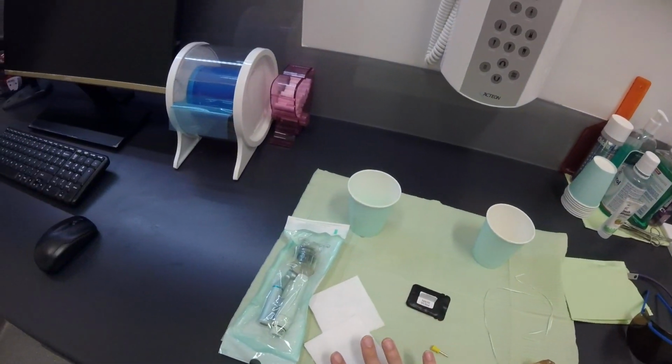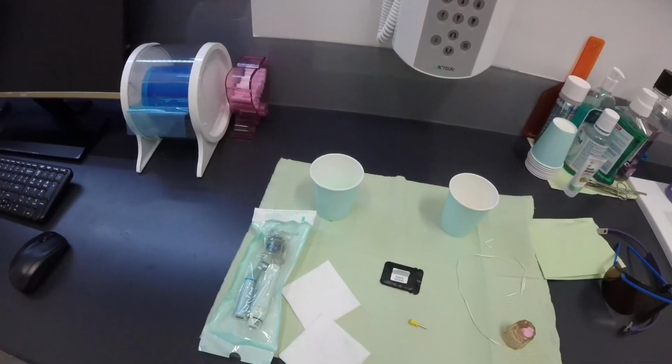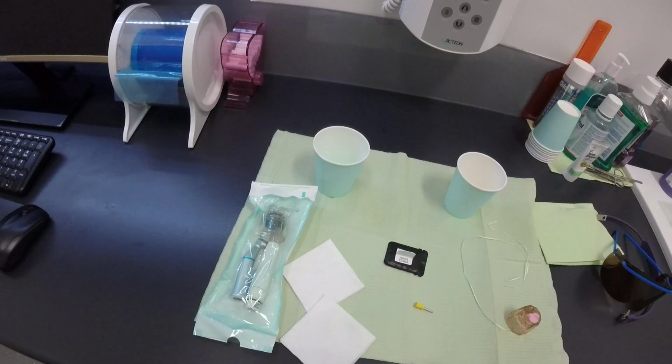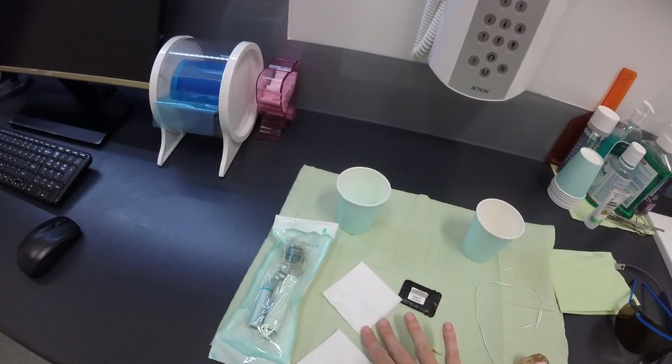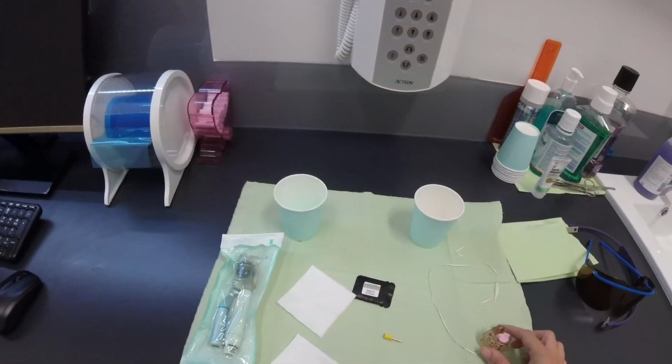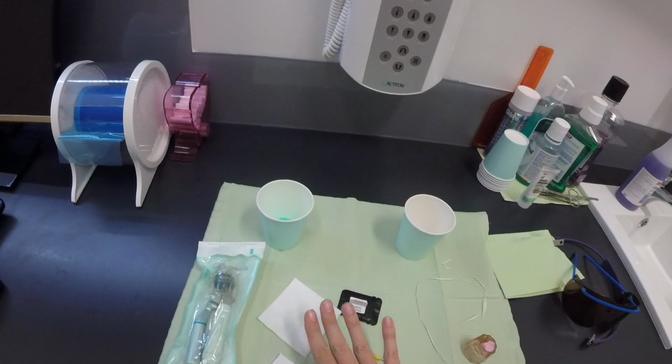We also have some gauze. So we have one piece of gauze for the dentist. They like to use that to wipe their mirror of any debris. Make sure you have a second piece of gauze out for yourself. This is for patient care. So if they get any of the Prophy paste on their lips or anything like this, you can wipe them off at the end.